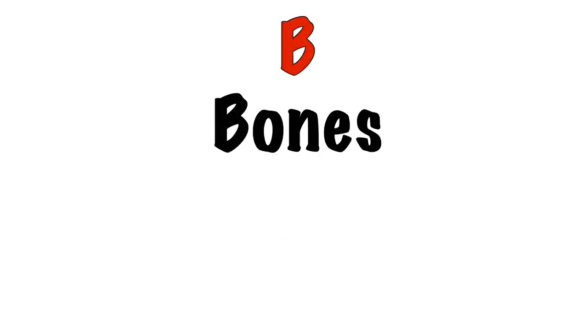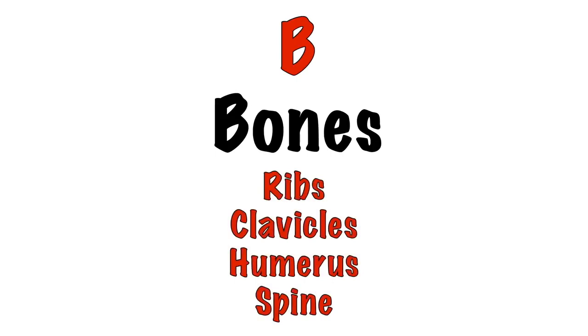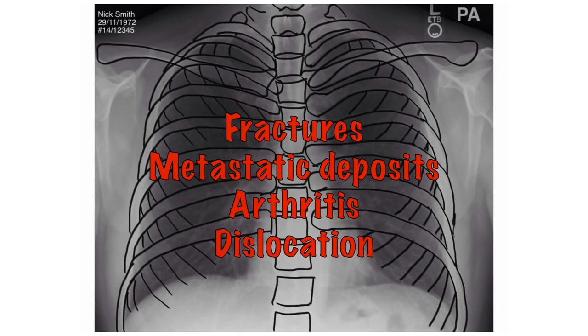B stands for bones. Look at the ribs, clavicles, proximal end of the humerus, and thoracic spine. Check for evidence of fractures or metastatic deposits, and examine the shoulder joint for signs of arthritis or dislocation.